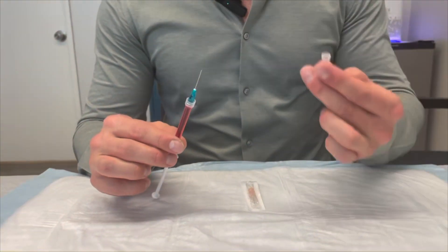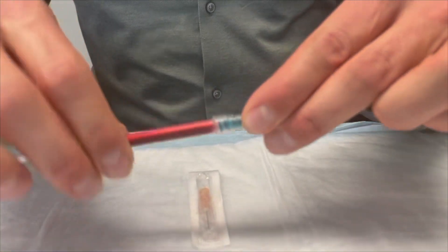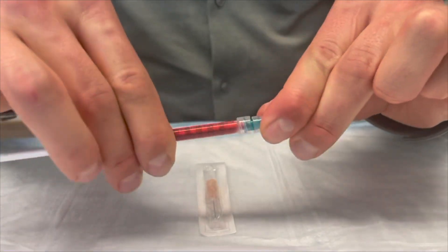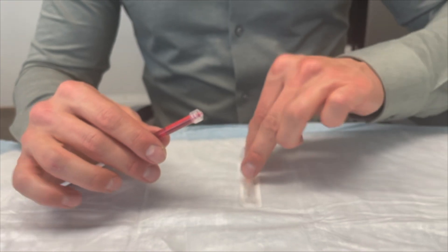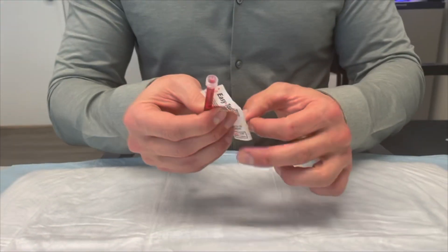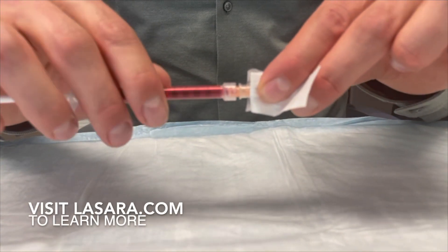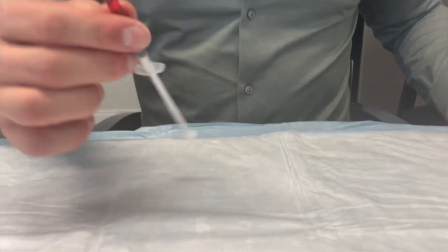Set the medication off to the side. Come back to the same cap, cover up the needle, and twist to remove the needle. Now to attach the injection needle — the five-eighths inch needle. Same thing: twist the syringe onto the needle. Now that we're prepped, I have my pre-filled syringe and my alcohol pad.